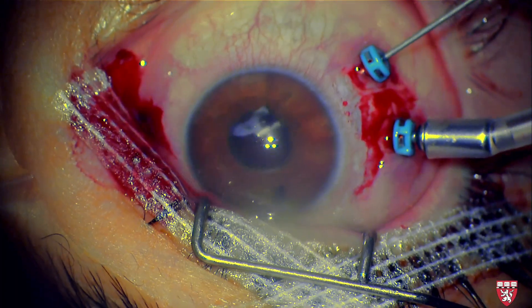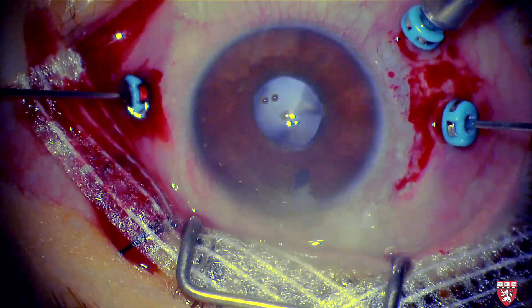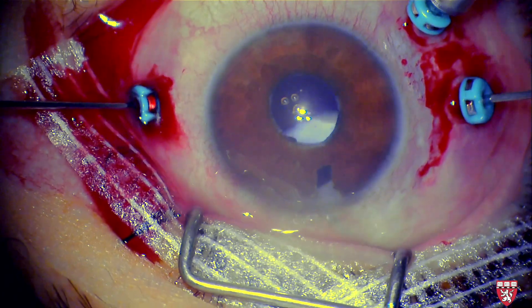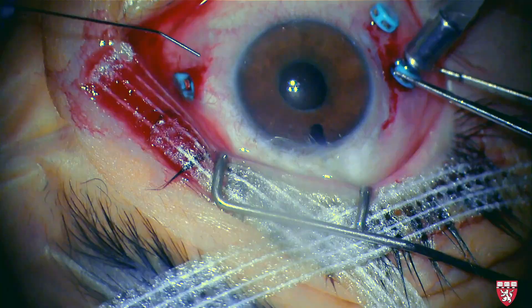We can now see removal of a dense white material which is located posterior to the iris. The surgery proceeded with the removal of the Sommering ring cataract. This material forms after cataract extraction when retained equatorial lens epithelial cells proliferate and form new cortical fibers. The obstruction of the peripheral iridotomy by the Sommering ring is relieved.